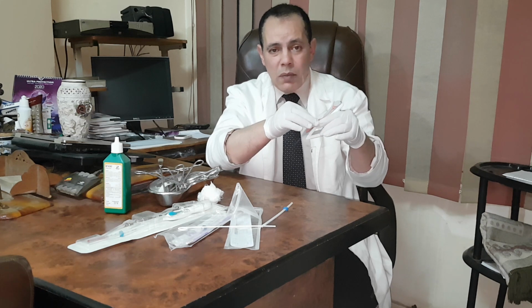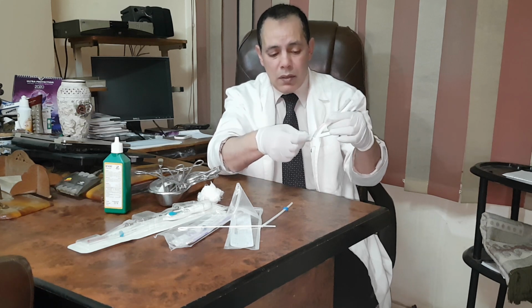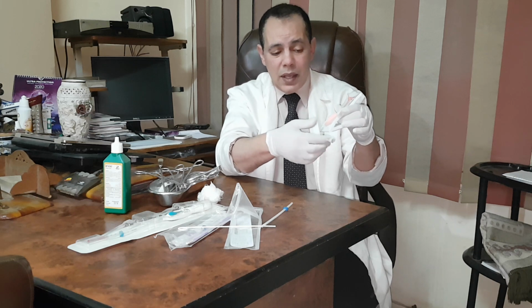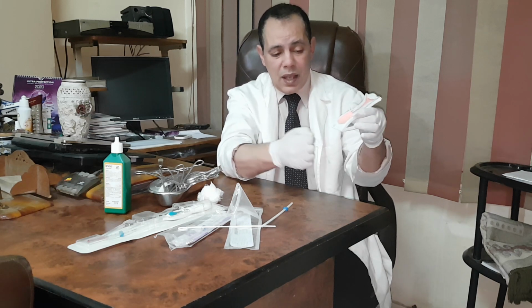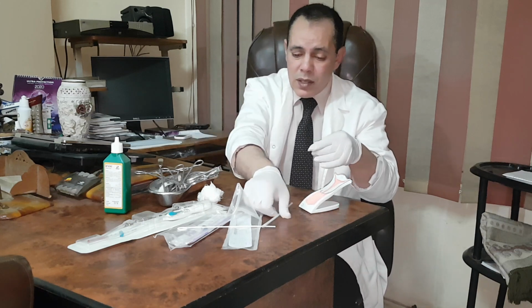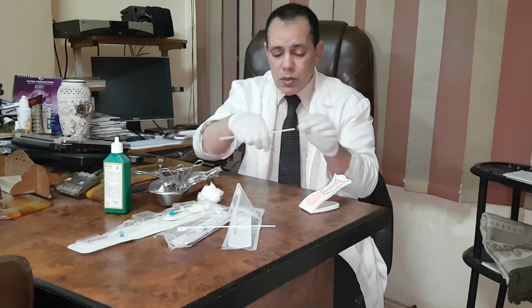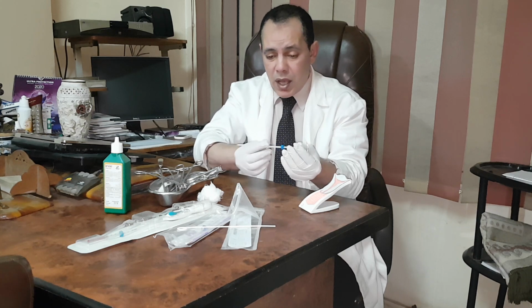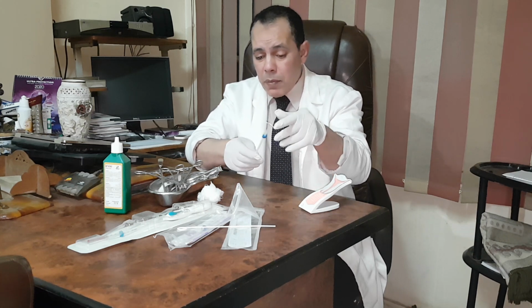This thread is important because when I want to remove the IUD later on, I can hold it like that and withdraw it out. So this is the withdrawal technique used with the copper IUD.